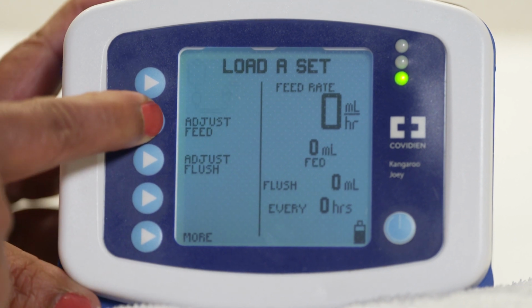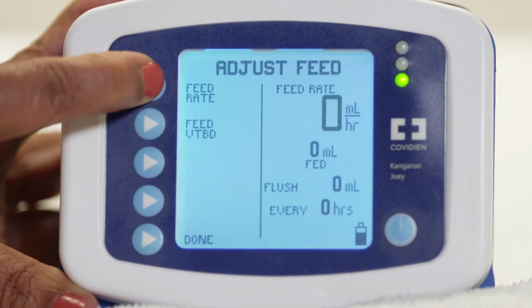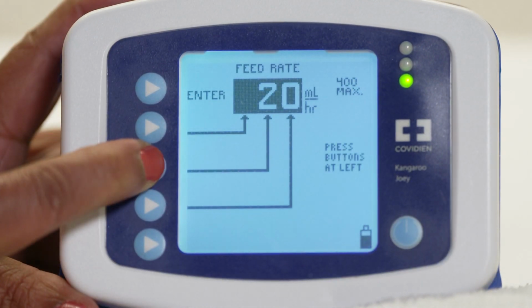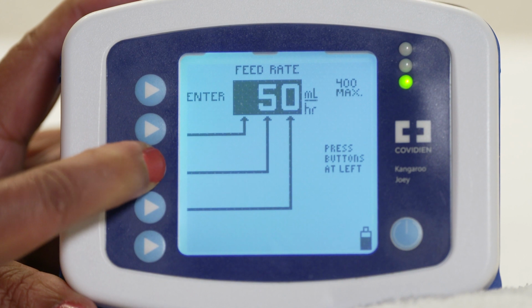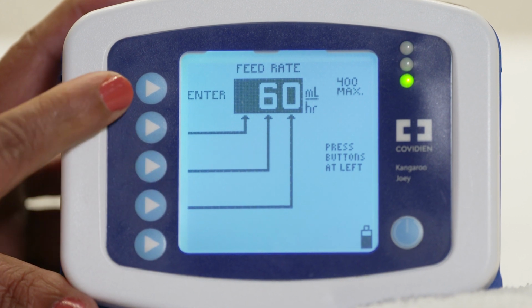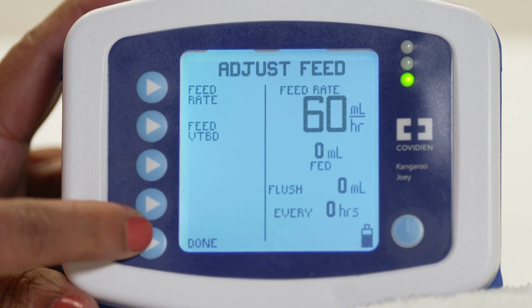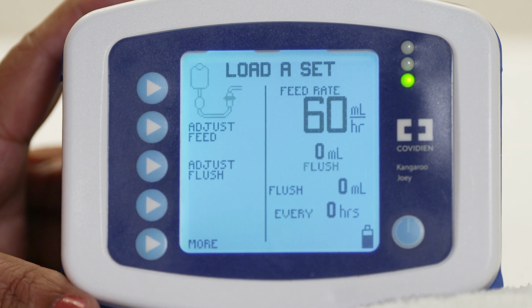The menu selection is on the left corner of the pump. Press Adjust Feed Rate, then press Feed Rate. Using the navigator buttons to the left, use the appropriate arrow to set your prescribed feed rate. Your dietitian will give you written instructions about the feed rate and flush rate. Press Enter at the top left corner of the pump. Press Done at the bottom left corner of the pump.